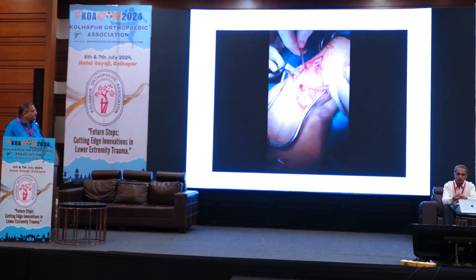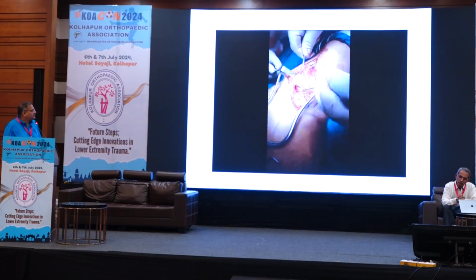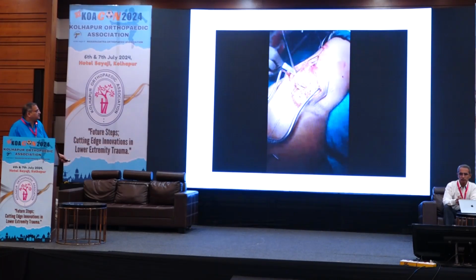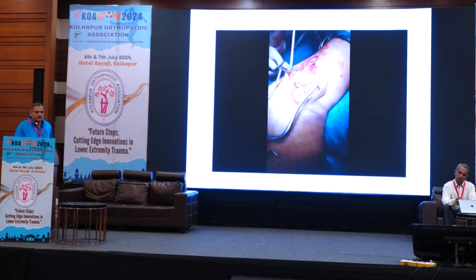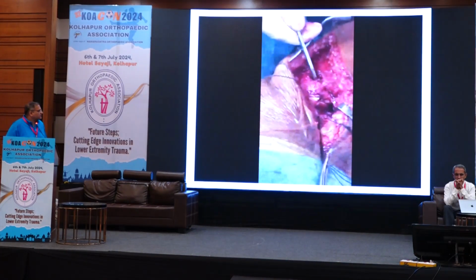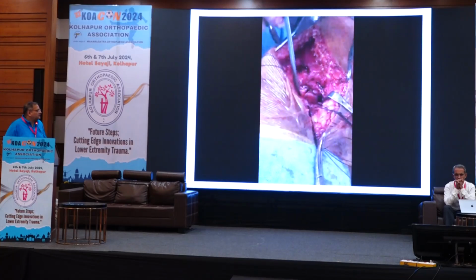So that's the video which shows that there is an anterior window, and you can see that it is elevated properly. Then whatever is the void, you put allograft there, which is readily available with us also. You can see that it is being elevated.